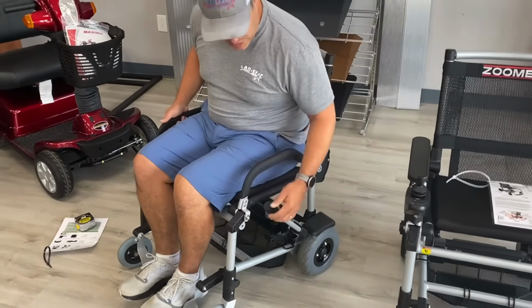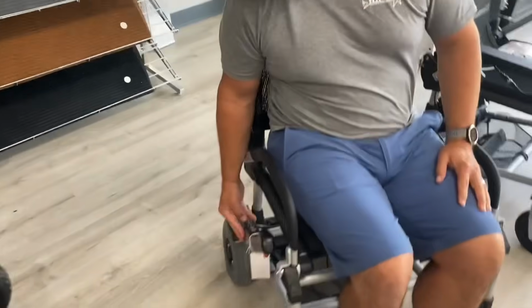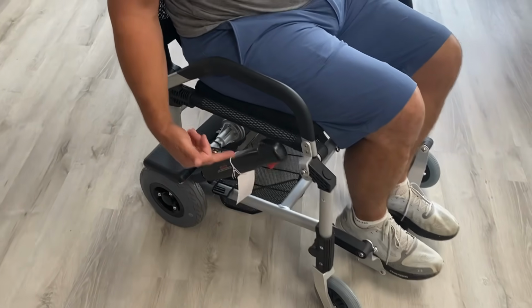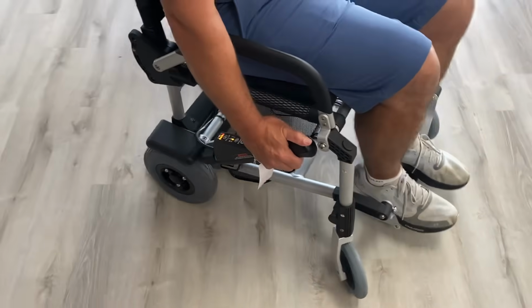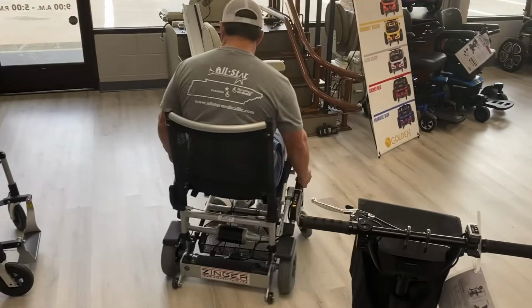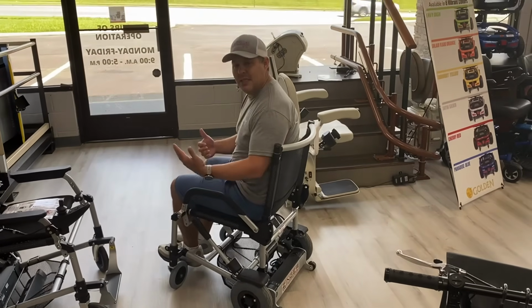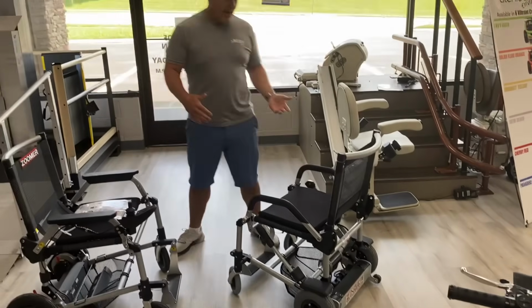They do not detach or anything like that, but they have a different drive mechanism. And what we have here is a button that you push, and then you can adjust speed, shows your battery life and everything right here on this. So it's a trigger setting. And as I'm sitting here driving, you will see I can drive around like this, and I have another handle on this side that helps me spin. Okay, so that's how this system works. You kind of drive it what I call like a skid steer or a bobcat or something of that nature. That's how that one works.